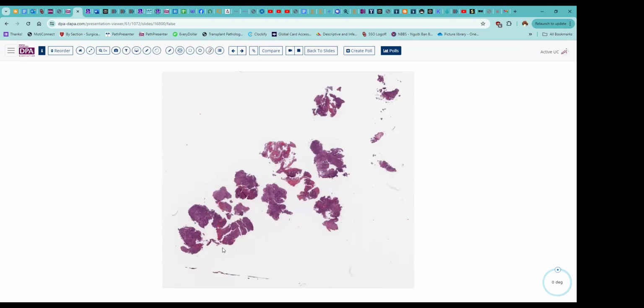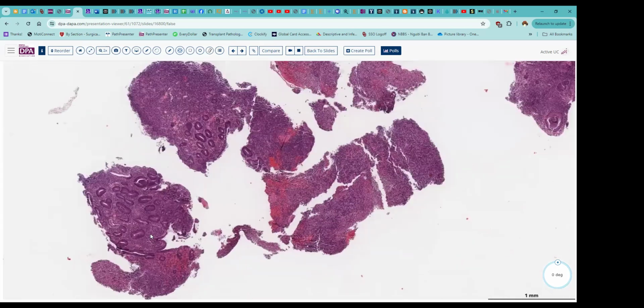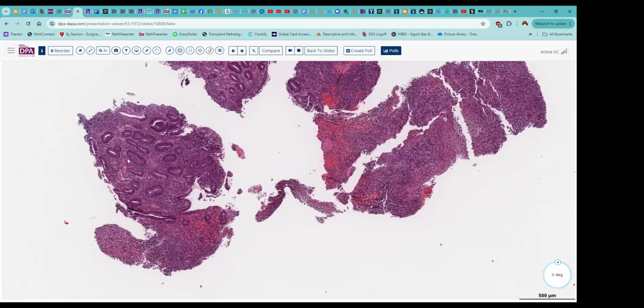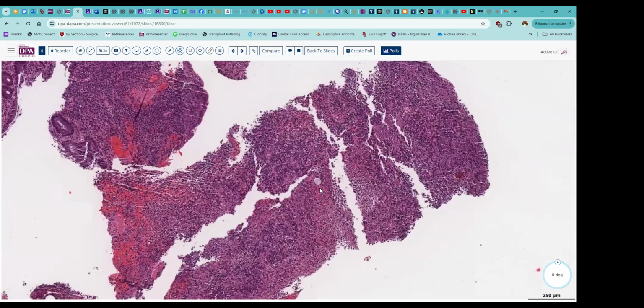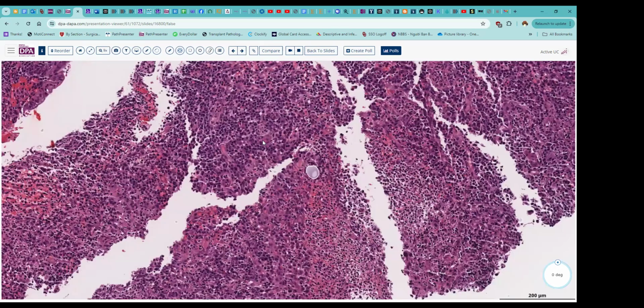This is, again, quite a blue biopsy. We have a lot of blue cells in here. I don't see much in the way of normal mucosa at all. And coming down, we see that there are some residual glands here. They're in variable sizes, a little bit of almost granulation tissue type of appearance here. Here's a destroyed crypt, maybe some food particles. Lots of plasma cells in here.